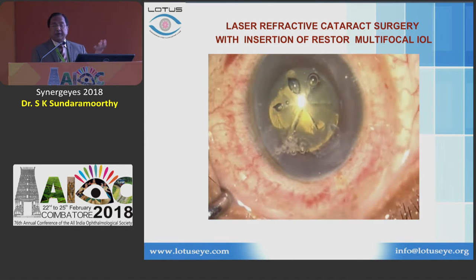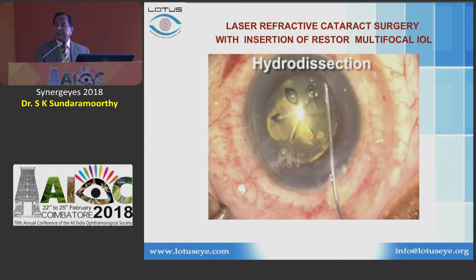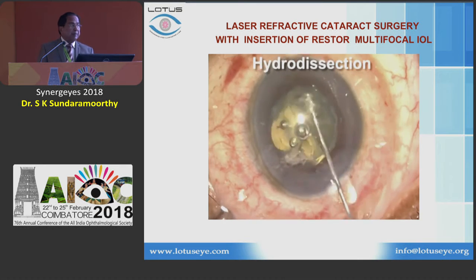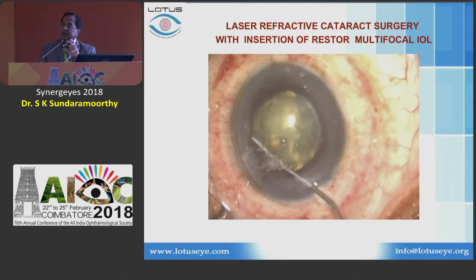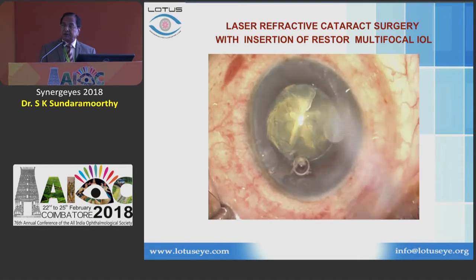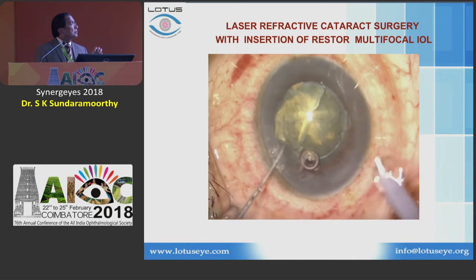Next, once you remove that, you know that you have a piece of cortex also. That cortex goes with the capsulotomy because you cut 325 microns, you go below the capsule. And then you can see small amounts of fluid are enough to bring the air bubbles to the front, and the technology is very safe in your hand. Then you go ahead to remove the nucleus.